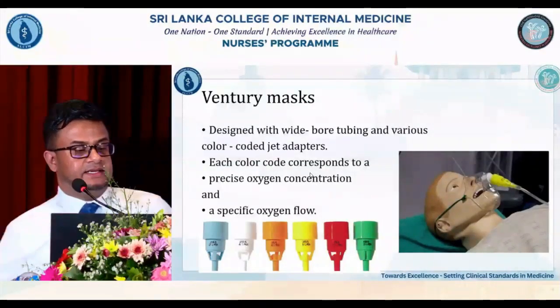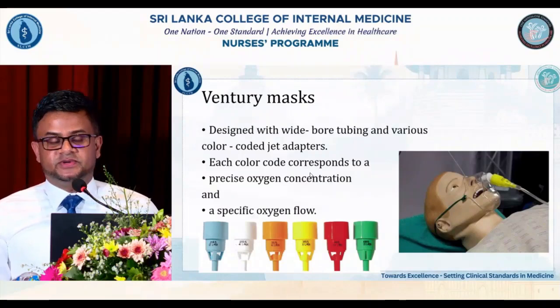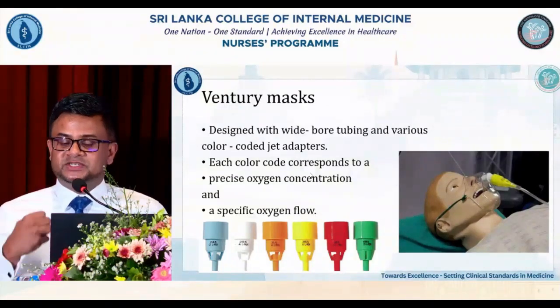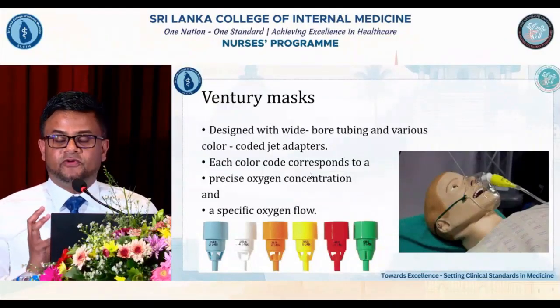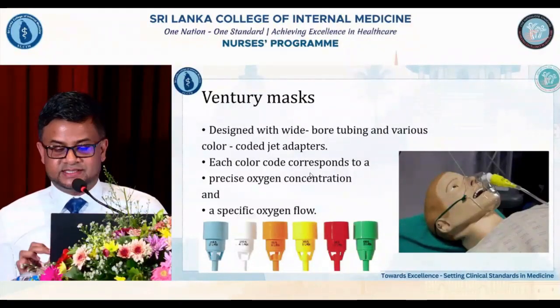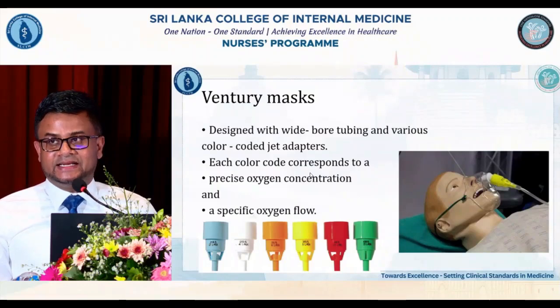Venturi mask, designed with wide bore tubing and various color-coded jet adapters. Each color code corresponds to a precise oxygen concentration and specific oxygen flow. Venturi masks provide an accurate concentration of oxygen regardless of the flow rate. Available in various concentrations, Venturi masks are suitable for patients needing a known oxygen concentration, with certain masks particularly suited for those at risk of carbon dioxide retention.